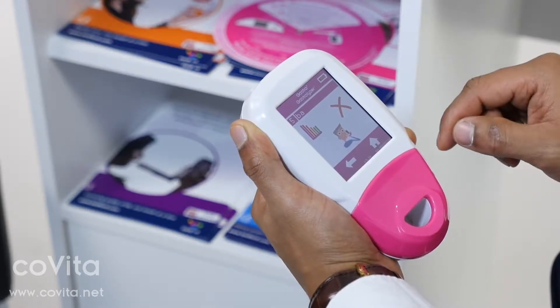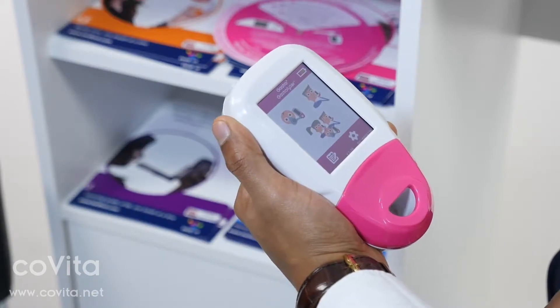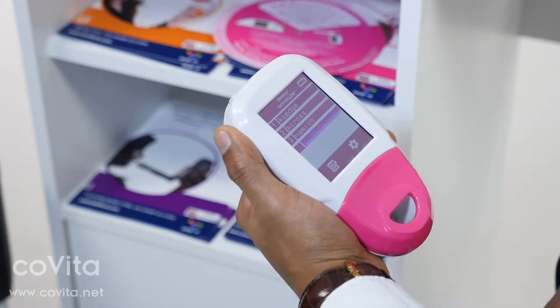This patient can now be used for protocol breath testing and you will also be able to see a graph of their results. To edit an existing patient, click on Register and then select the patient you wish to modify.